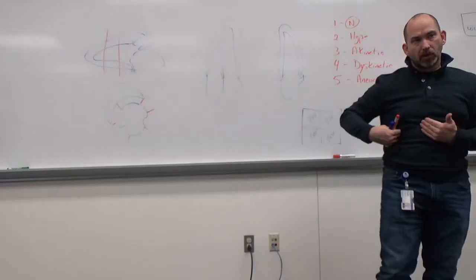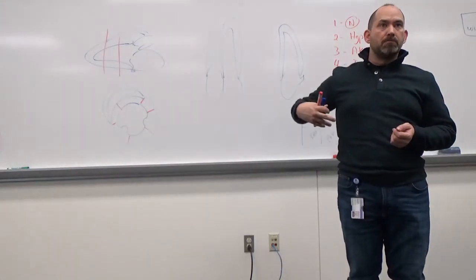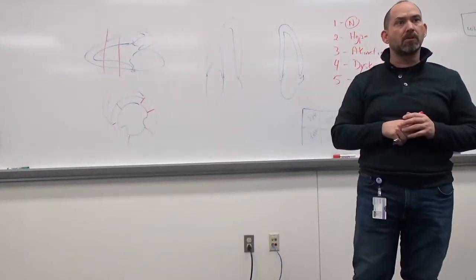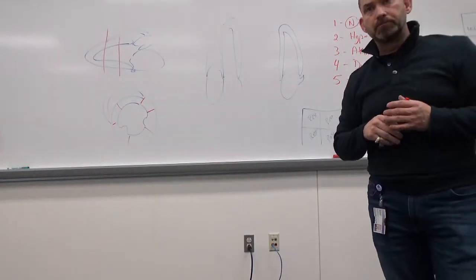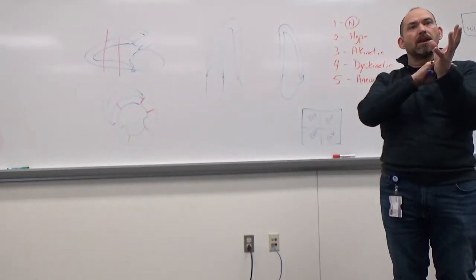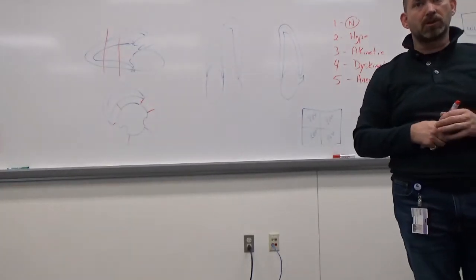If we're talking about a liver, for example, and it is now FDA approved for liver use in the US, they've been doing this in Europe for a long time. What they'll do is a cancer, what do you know about the blood supply of a cancer? Is it the same or different than the blood supply, or the demand on blood supply, I guess, as compared to regular tissue? They're pretty vigorous, so it fills it up really quick. So if I'm looking at a liver, that mass lights up first, and then I see the rest of the tissue. So you can actually see the definition of the mass by the blood supply of it. That's where they use contrast in looking for masses.